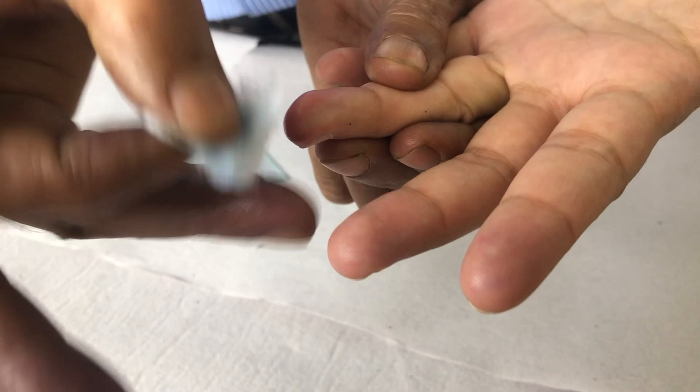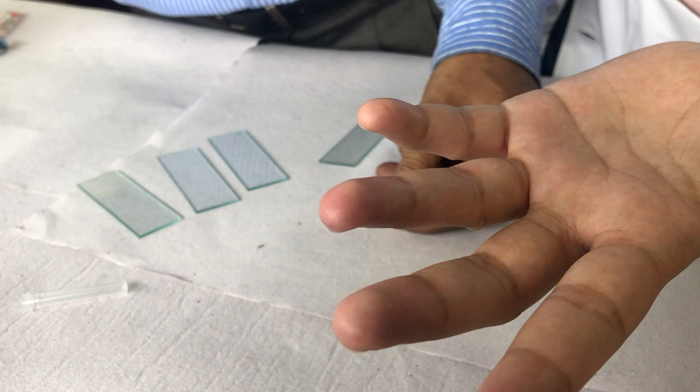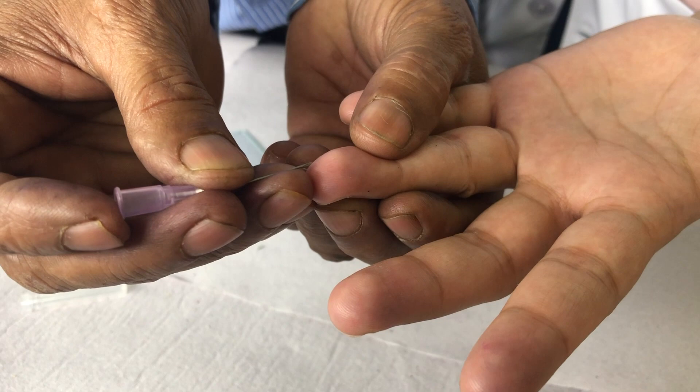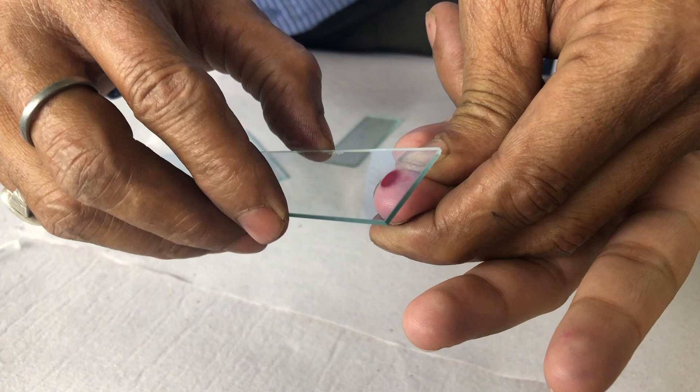For making the prick, we can use the ring finger. We need to wipe clean the ring finger with spirit and use any disposable needle for this purpose. A sharp prick is to be made, and you should ensure that you should not squeeze that.